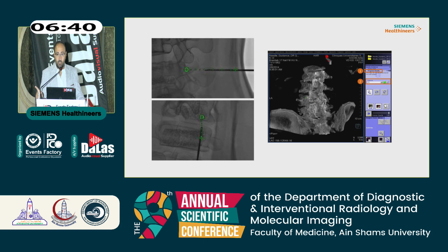One of them is a bullseye projection where the detector, the tube and the needle are aligned on the same line, and the other 2 projections give precisely the best angulation to see our needle according to the track we already chose. The physician can swivel between the 3 projections every time he advances the needle to see it until reaching the target.